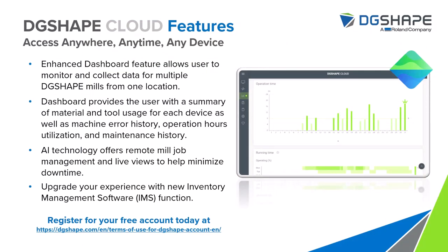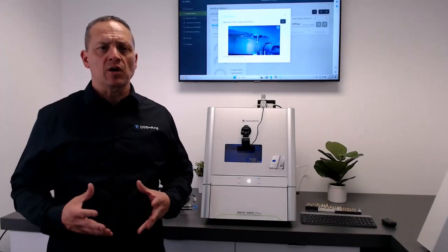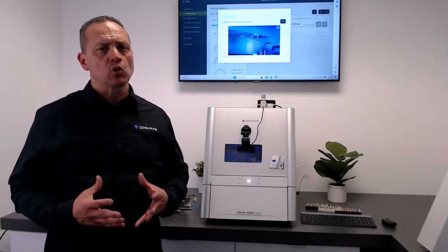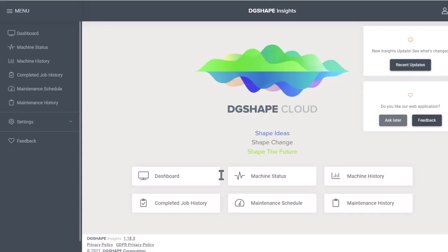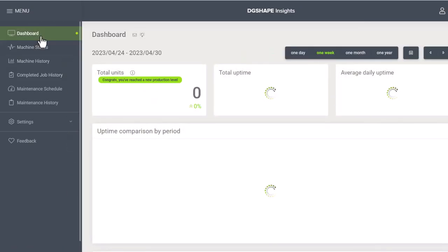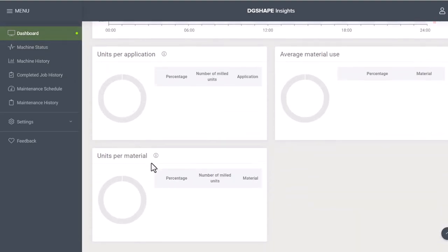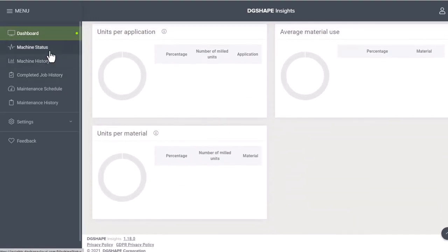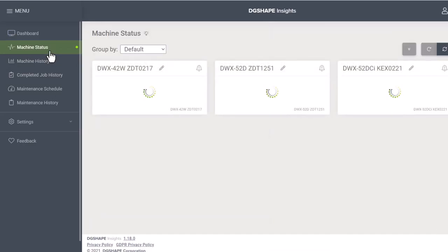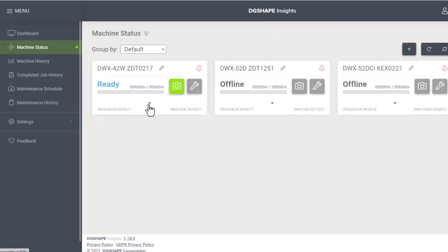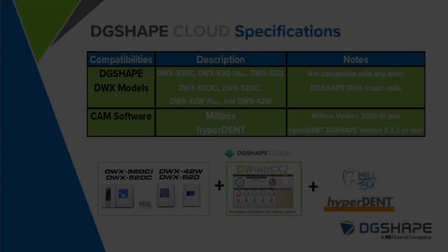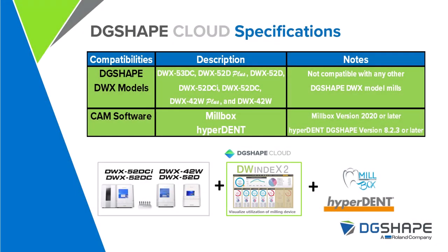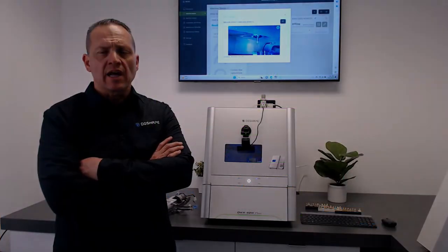DG Shape Cloud features Dashboard provides the end user with a summary of materials and tools usage for each device as well as machine error history, operation hours, utilization and maintenance history. AI technology offers remote milling job management and live views to help minimize downtime. Enhance your experience with the new inventory management software IMS function. Register for free. DG Shape Cloud is compatible with the latest DWX models. Also compatible with the latest software versions of MillBox and Hyperdent.